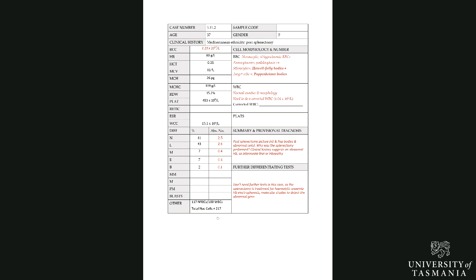And you can see here that the corrected count that I got was 6.04, so 6.0 times 10 to the 9th per litre. The formula that is given for you here is the same as the formula for last week, which is different to the formula from the week before. So I think the original formula that you were given is the easiest one. I don't really mind which one you use. Both of them give the same answer. The red cell count you had to calculate, and it should have calculated out to 3.1 times 10 to the 12th per litre.